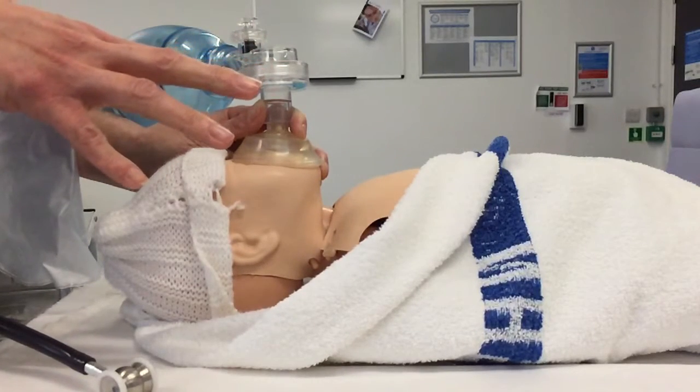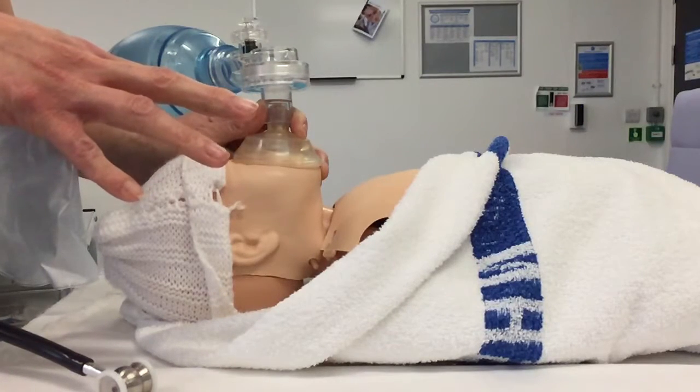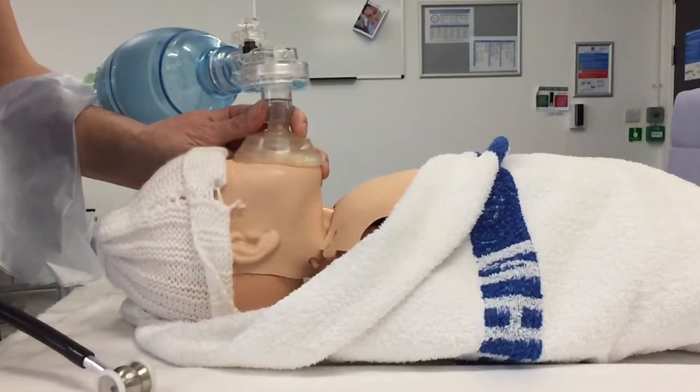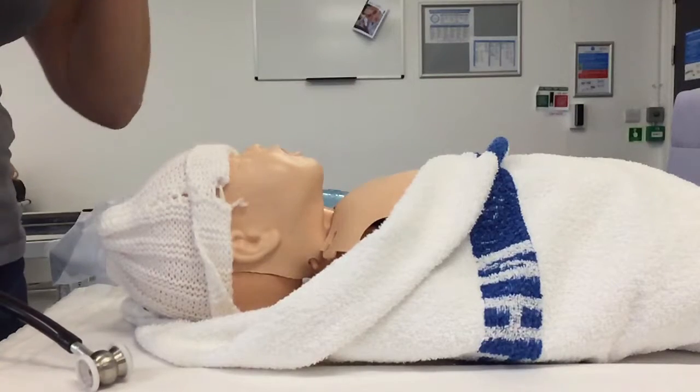Did I see chest rise with my inflation breaths? Again, we could see that you got the chest to rise really nicely. If you hadn't seen the chest move, what else could you do? Colour and tone are the same — still the same. So if that hasn't worked, I really want to go on and think about some airway opening manoeuvres — so a jaw thrust.